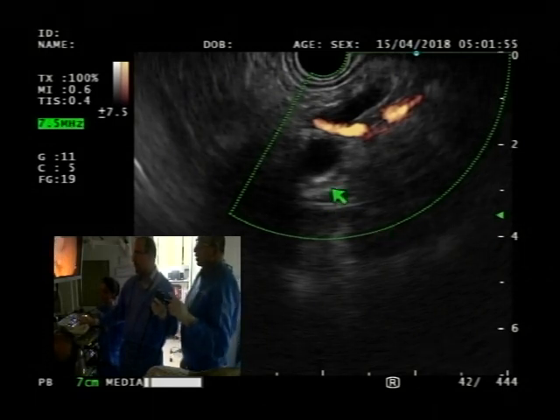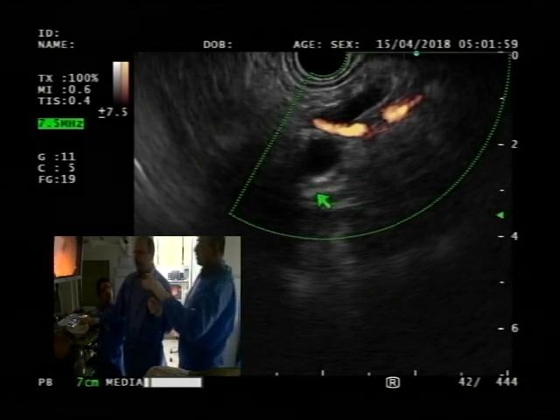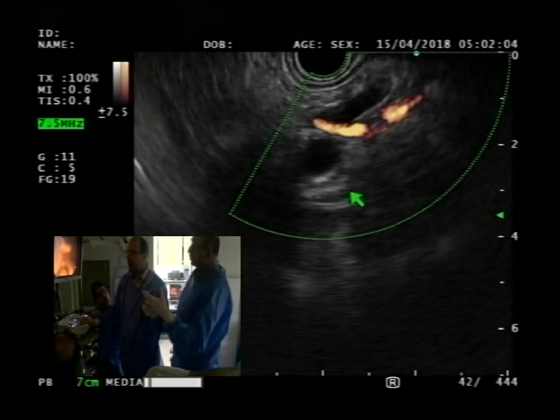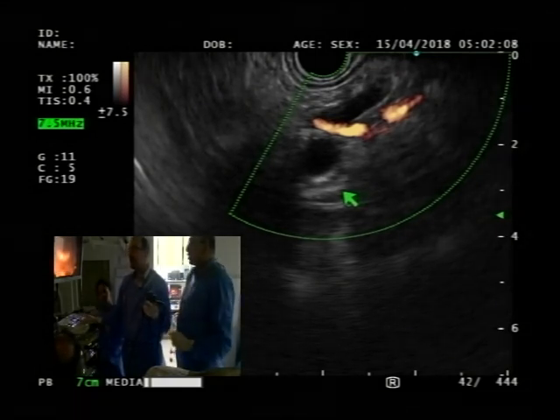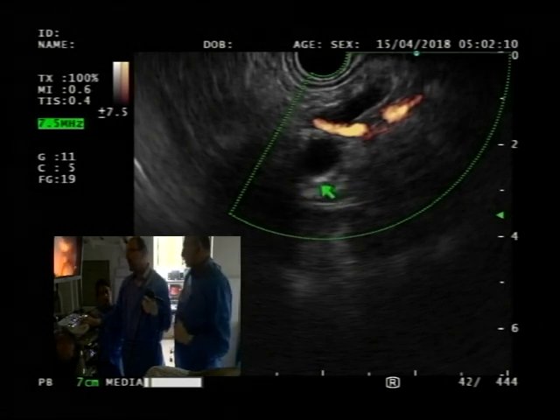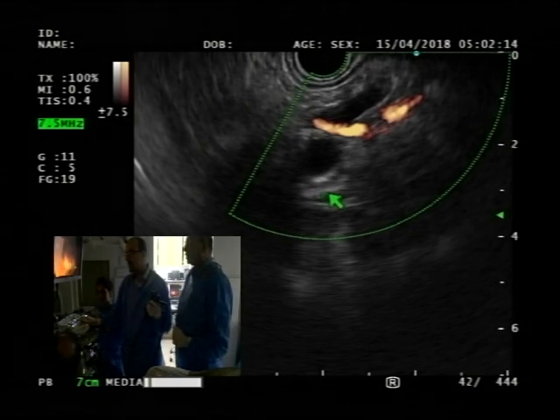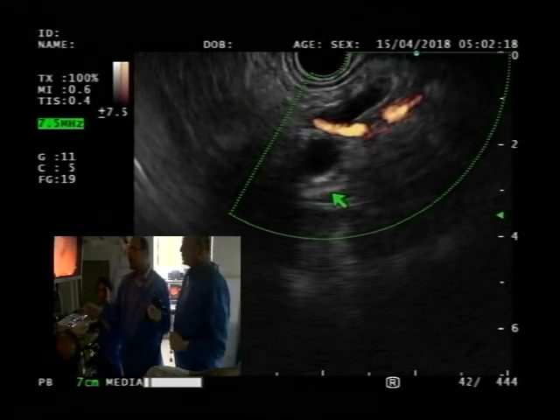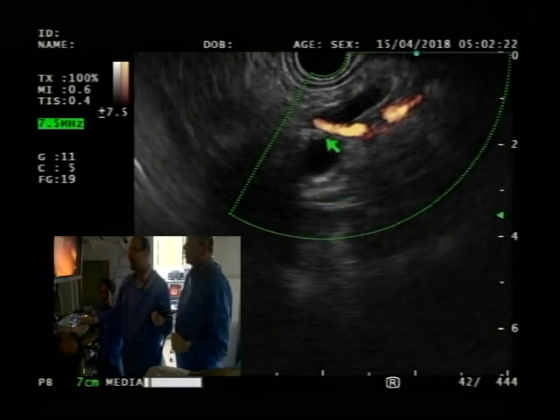So this is in the stomach. In the stomach, how much of the bile duct are you expected to see? Do you assess it from here? You don't typically assess it from here. Oh, right. So you have to go to the duodenum. This is mainly for the pancreatic mass. This is usually learned later in your development. Honestly, I wasn't taught this much, so that's why mine was later on. But there's no harm in learning it. It's good to learn it early.